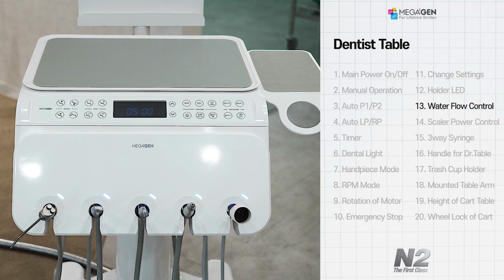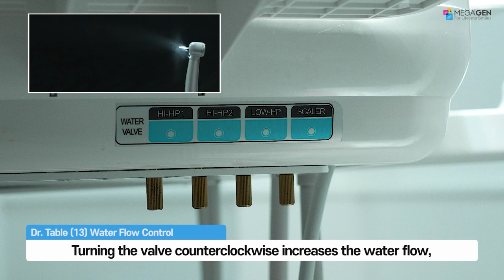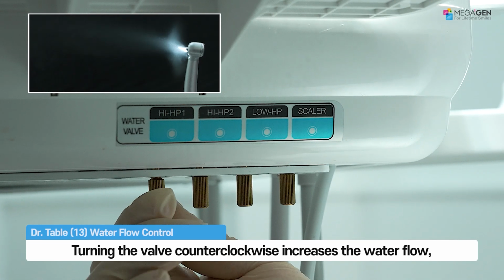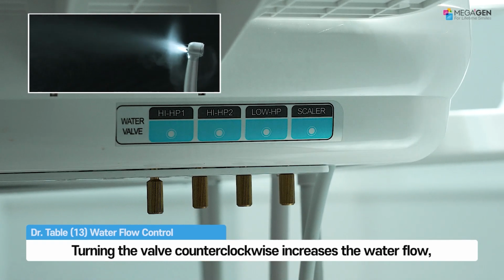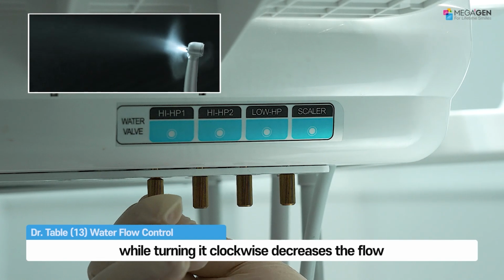Handpiece water flow adjustment. There are 4 water flow adjustment valves, located on the lower right side of the doctor table. Turning the valve counterclockwise increases the water flow, while turning it clockwise decreases the flow.